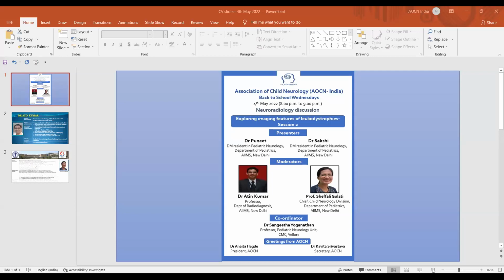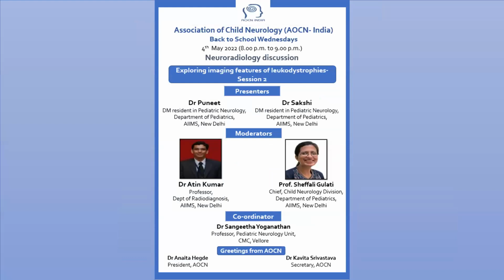Second neuroradiology session on exploring imaging features of leukodystrophies. In the first session, we discussed the imaging features of adrenoleukodystrophy, metachromatic leukodystrophy, and Krabbe's disease. Today, we will be discussing a few other interesting cases of leukodystrophies that we see in our clinical practice.